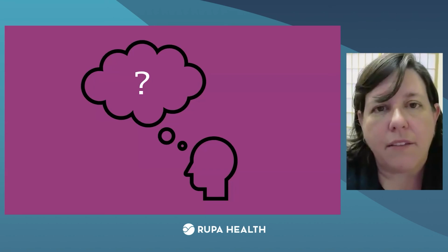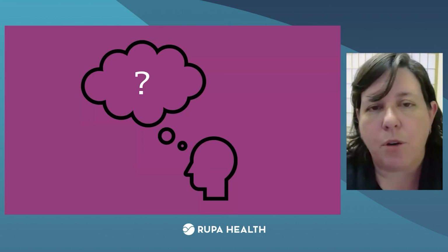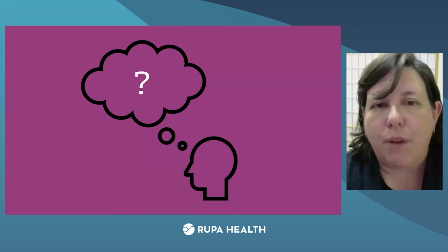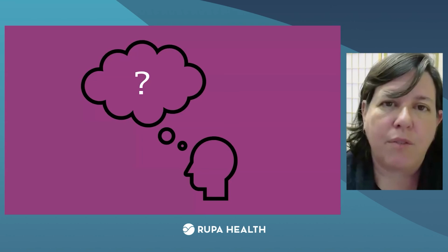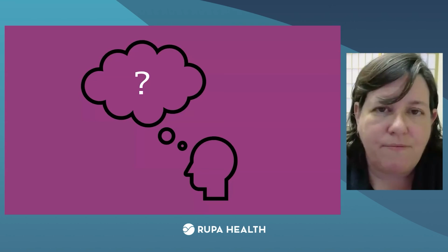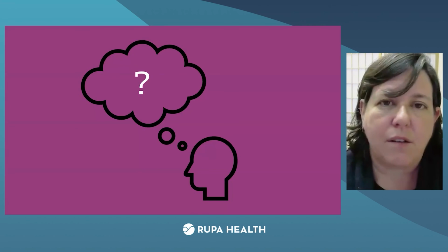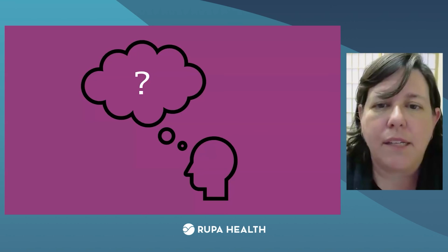I have tested on the day of testing if they're taking thyroid, but if they're on T4, it's fine. You can take it anytime, no problem. If they're on T3 and they took it that morning, bring them back in and do it at least 6 hours later. And like I said, the beauty of a blood spot is they can just do it before they take it in the morning, and they're not even going to skip that day's dose. They can do both of them before they go off to work. So it makes it super easy.